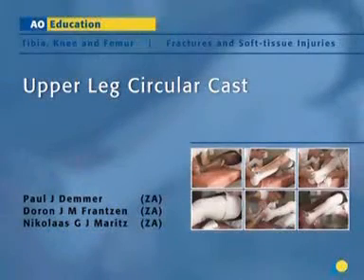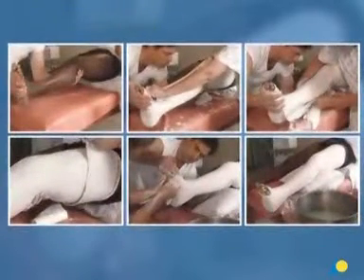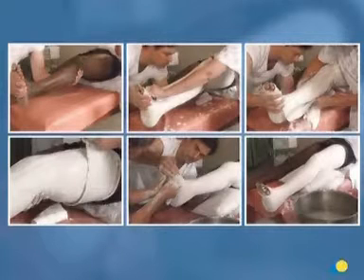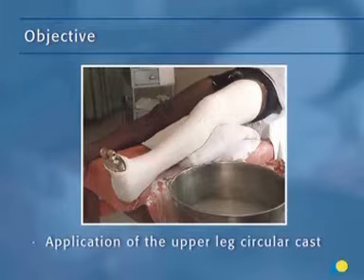The upper leg circular cast is usually applied for fractures and soft tissue injuries of the tibia, knee, and femur. In this presentation, the application of the upper leg circular cast will be demonstrated. The objective of the exercise is to show the application of the upper leg circular cast, a plaster cast that will stabilize the fracture or soft tissue injury.